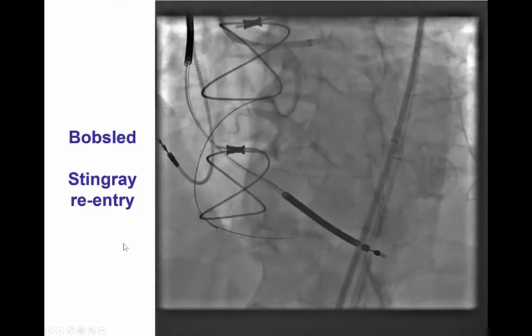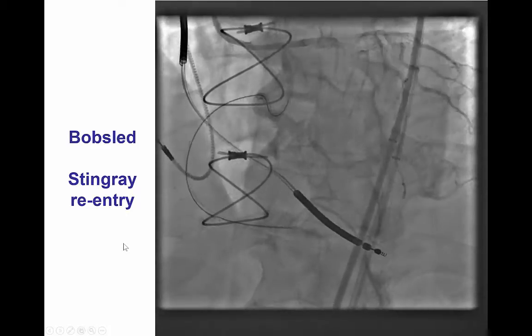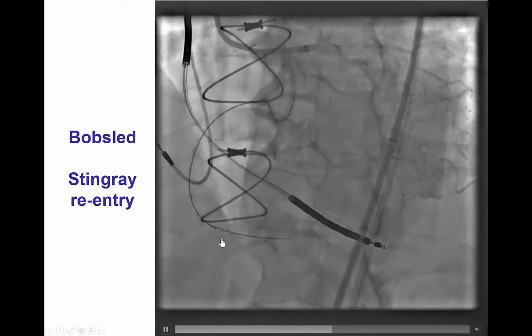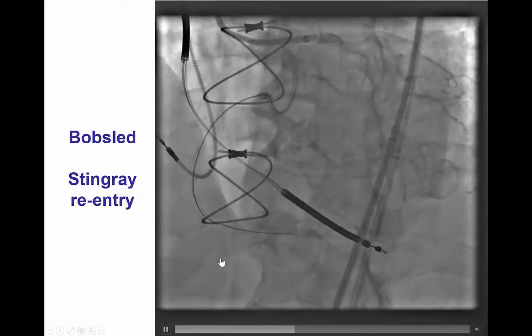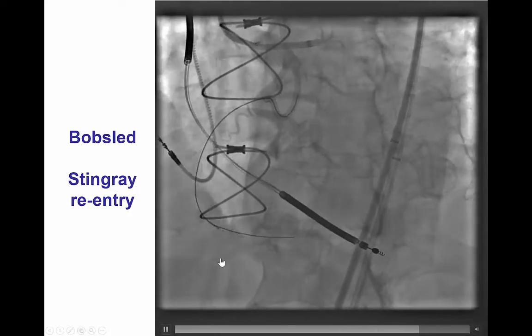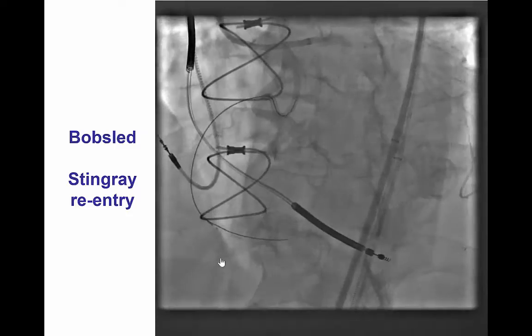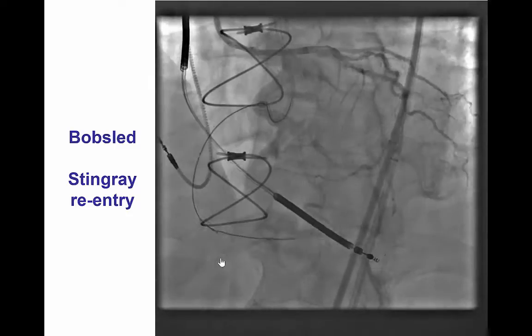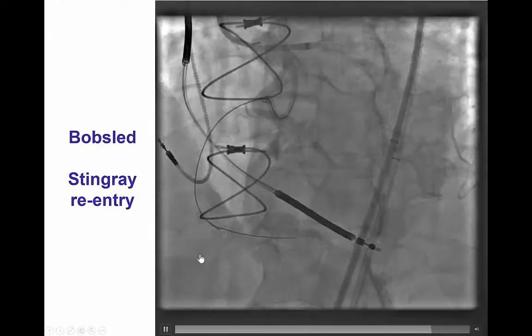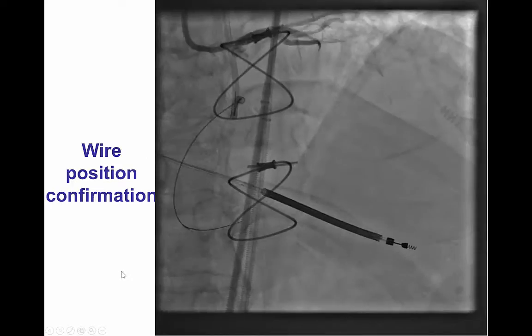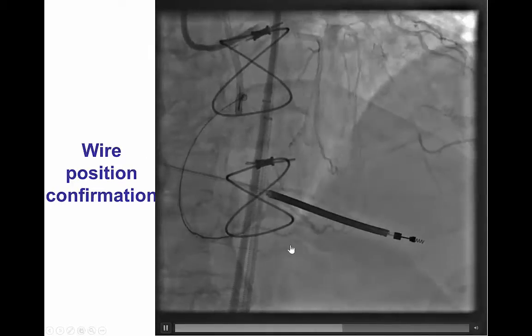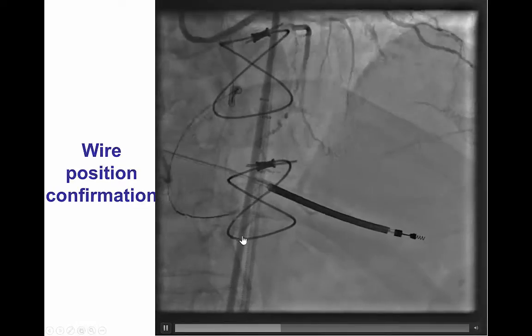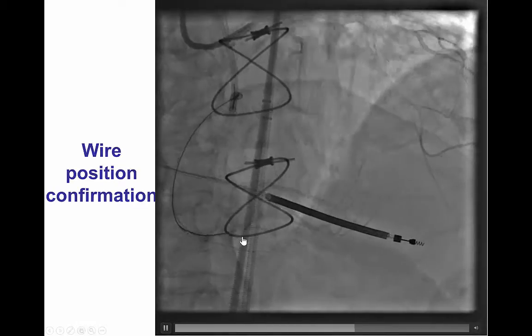So we advanced further down — that's called bobsled — and attempted re-entry in the vertical part of the right coronary artery. We performed the Stingray wire technique, and the Stingray actually went into the distal true lumen, as shown in this view as well as an orthogonal RAO view. So we have successful re-entry into the distal true lumen.